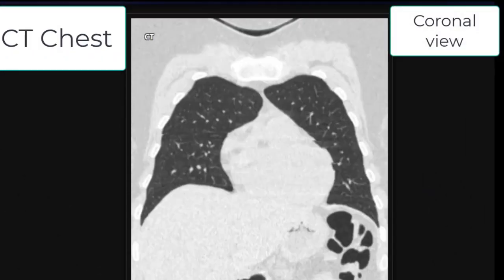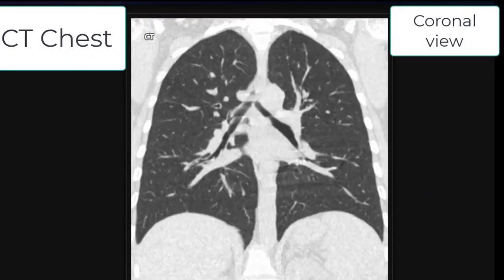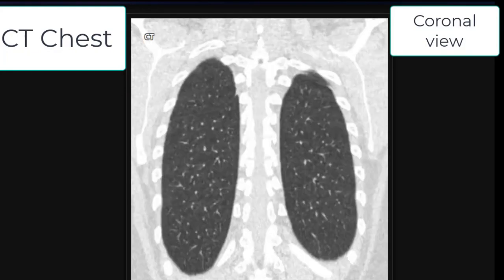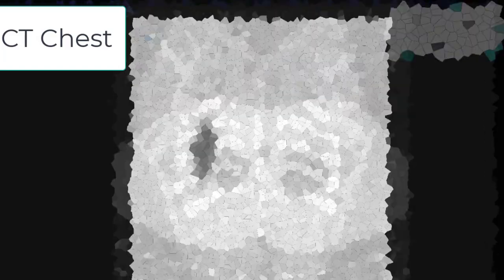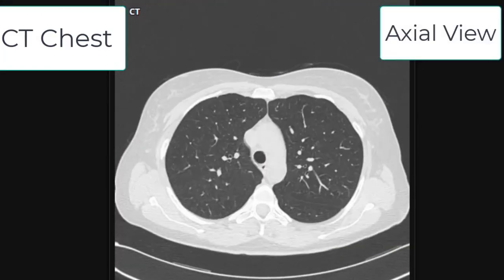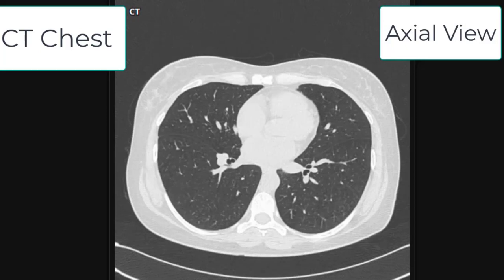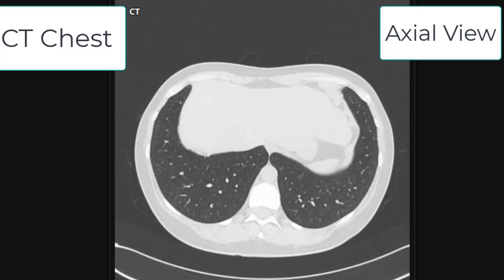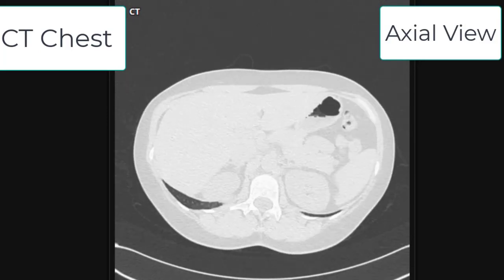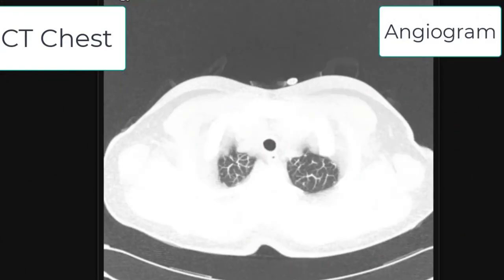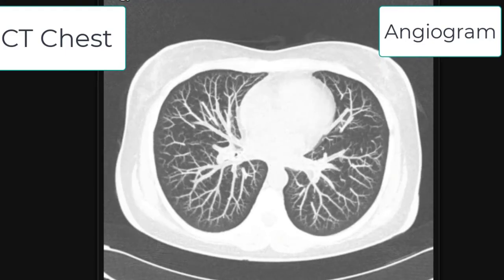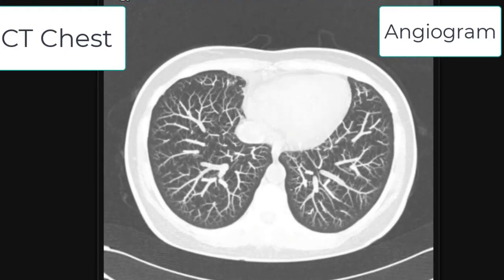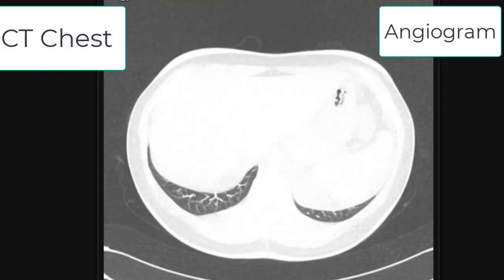This is the CT chest in coronal view, showing the anterior-posterior view of both lung fields. This is the CT chest in axial or transverse view, showing both lung fields and the heart. This is the CT angiogram of the chest, showing the vasculature of the lungs in a normal patient.